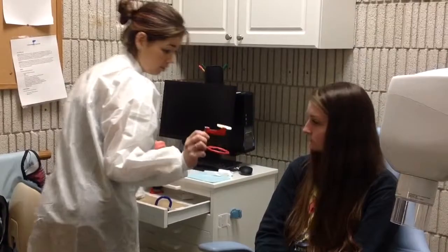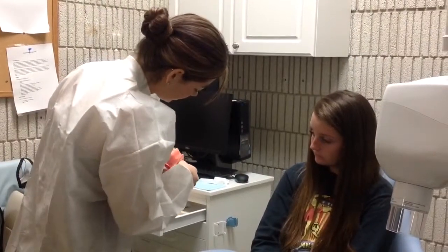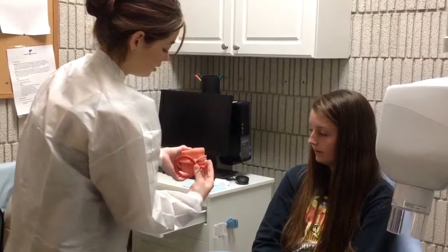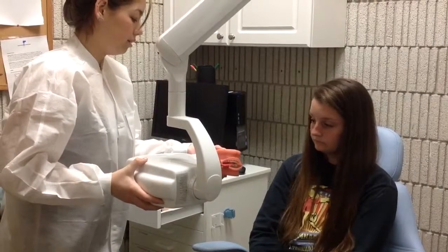And then we have the same one, it just looks a little different. This one's red, and this is to take the pictures on the side. See how you're going to bite down? Mm-hmm. So you just bite down just like this. And this little ring is going to touch your cheek. And again, my camera points right there. All right? Mm-hmm.